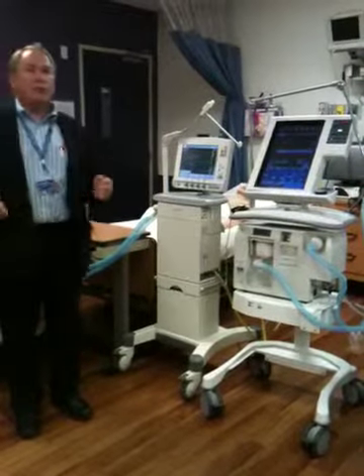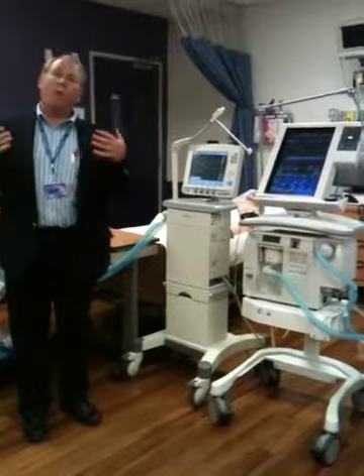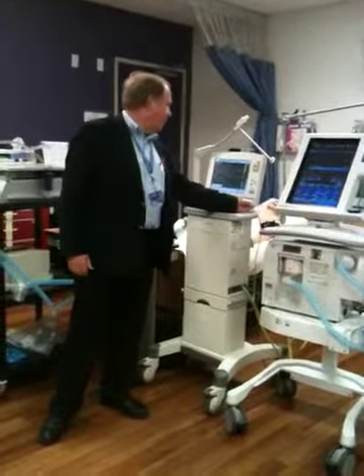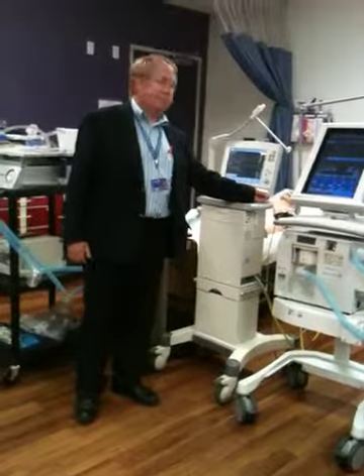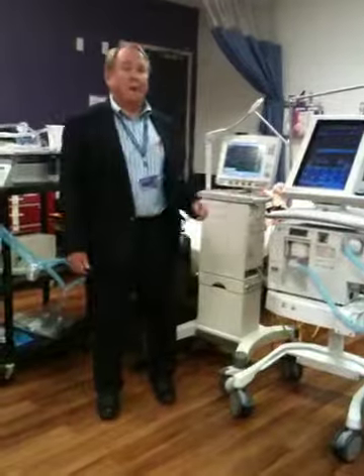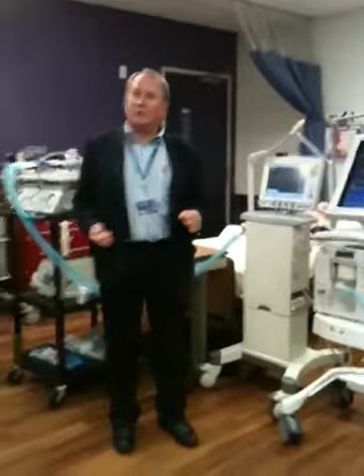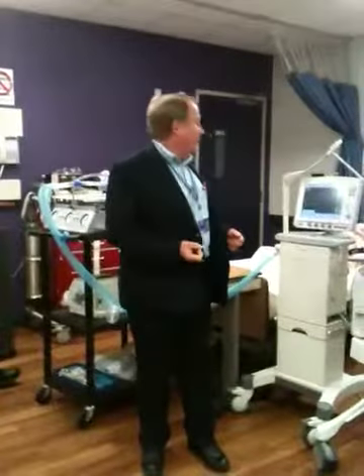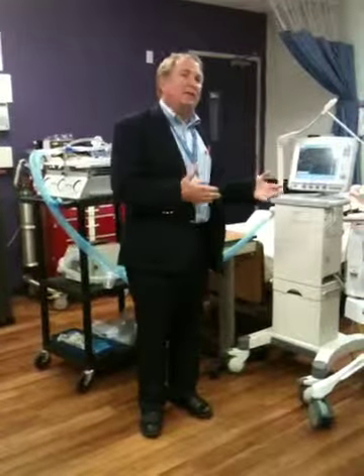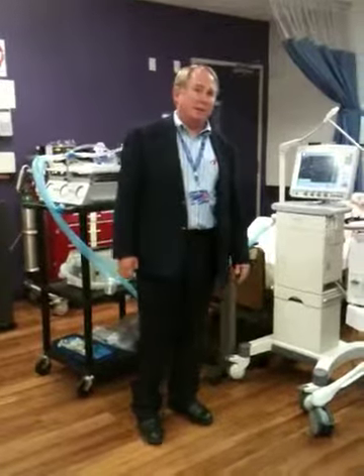And in order to get a true static compliance, I have to have my patient cooperate. If I come in and say, just going to have you hold your breath here. Patient's not going to like it too much, and they're going to fight it. So anything more than about a 0.2 of a second pause, they're going to start bucking the ventilator. We don't want that, so therefore we look at it, do it quick, and then do our calculation and be done with it.